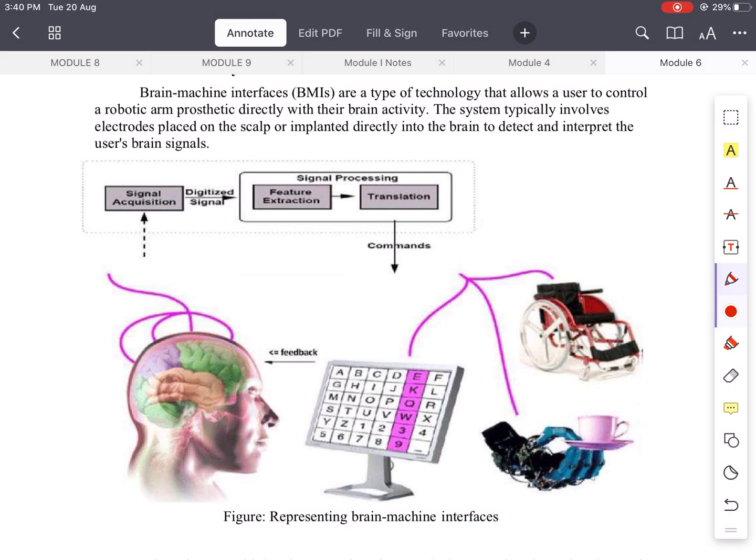The main release of the electric signal is from the brain, so from the brain only these electric signals are picked, from the headgear to which the electrodes are inserted. This electric signal is then passed to signal acquisition and collected. Then in the signal processor, the signal processing is done to generate the command. This generated command can control the limbs.